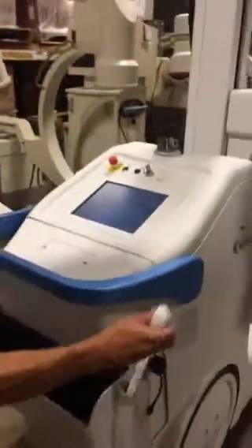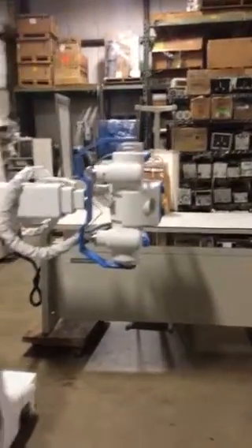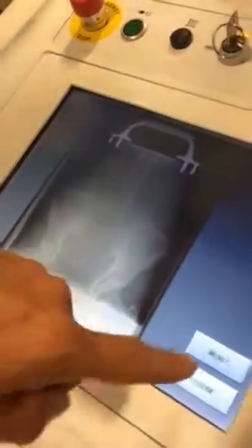We're going to make our exposure. Now the image will paint right on the screen. If you want to look at that image bigger, you can QA it and you can mag it. You can adjust that image if you want. You can close this, take another exam, whatever you want to do from there. And it's that easy.